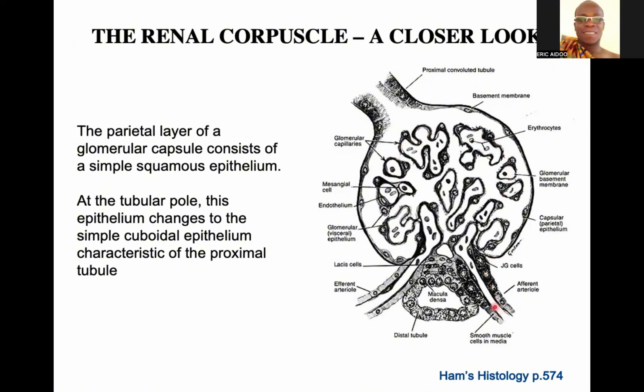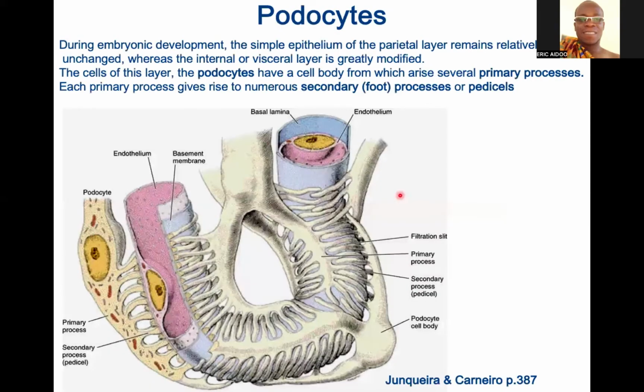So that is afferent arteriole, and that is efferent arteriole. And then that is distal tubule with macula densa cells, that's the lumen. Then at this portion, you have lacis cells. You see them in a clearer picture later on. Then within the afferent arteriole, you have these specialized smooth muscle cells known as the juxtaglomerular cells. Then within the glomerulus, you also have mesangial cells. Mesangial cells.